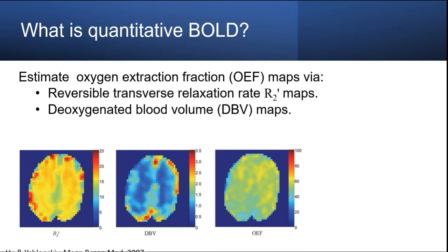And then we get these relatively flat-looking OEF maps. Often what people strive for is this idea that the OEF is constant across the whole brain, although it's not entirely clear to me whether that's realistic in healthy physiology. It comes more from looking at PET literature where voxels are a lot larger and so the averaging is greater.